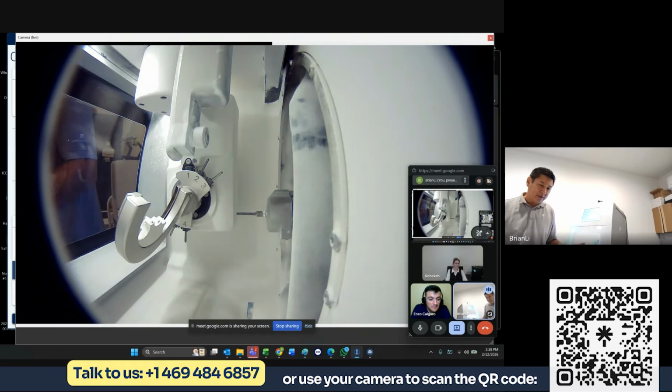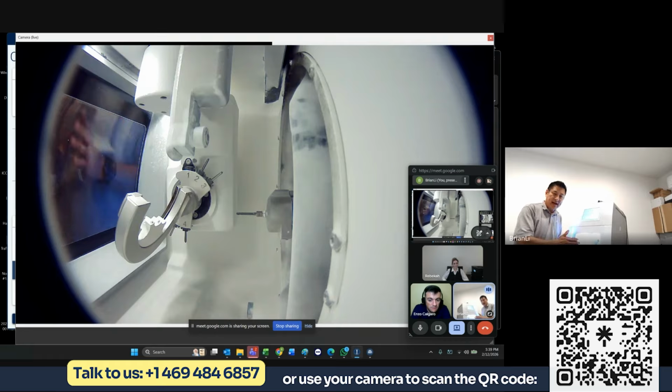By the way, if something happens and you need a recording of something that did not air, our help desk can remote in, and they do have access to those videos. They just don't record them onto the mill.